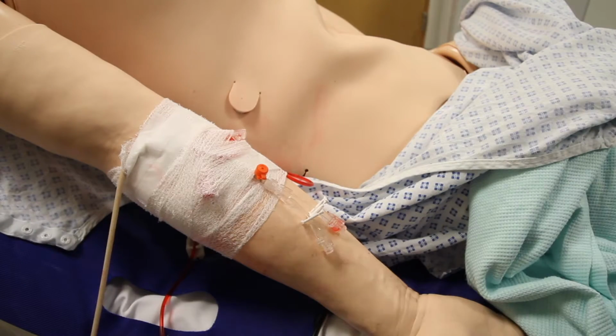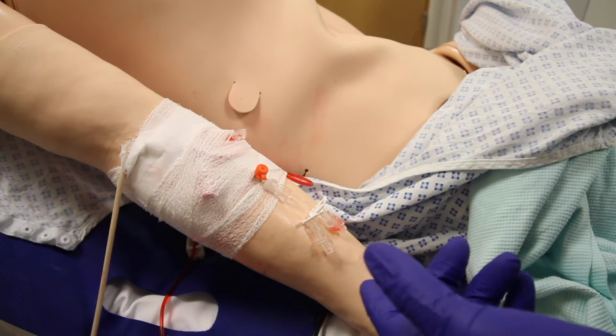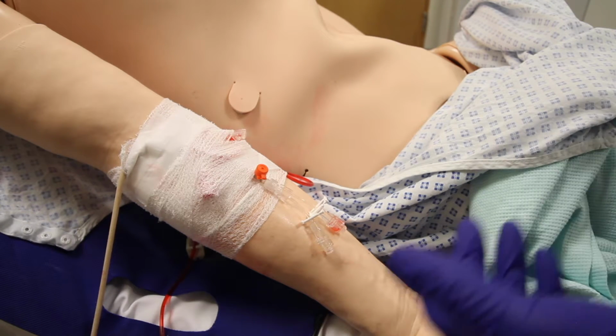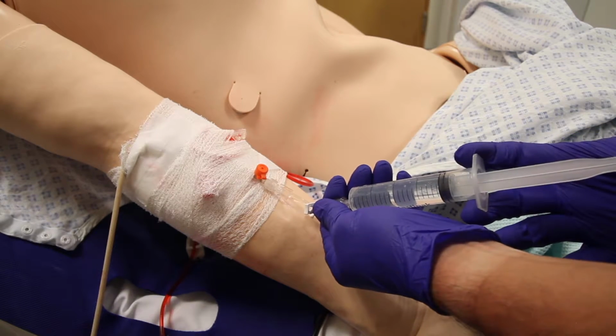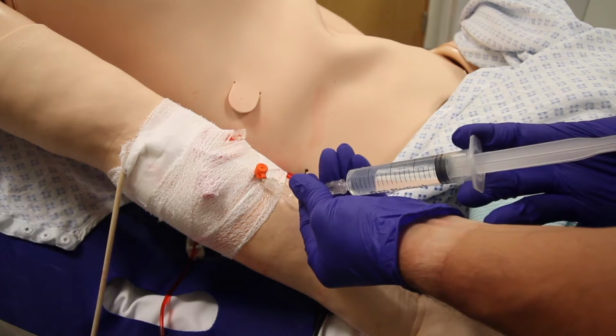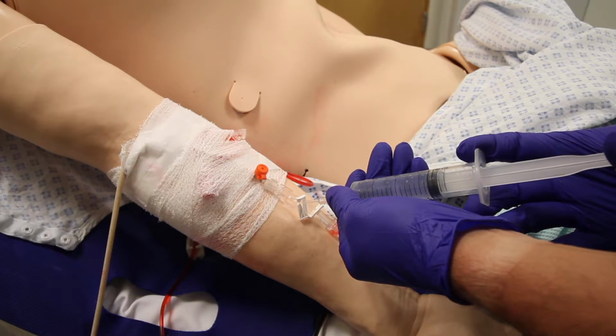He's got a cannula in there currently, and not very often in most of the scenarios that you'll be presented with, he will have a cannula that's working and flushed, and we'd expect you to use it like any other cannula. So you can see that if you just pop this in here, and then you push the fluid, he will flush nice and through.